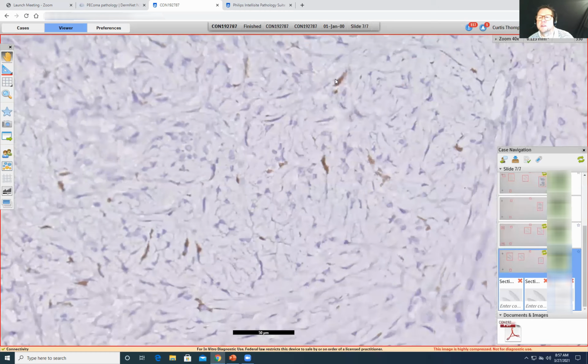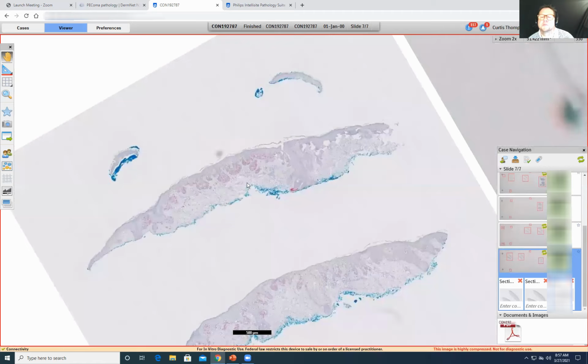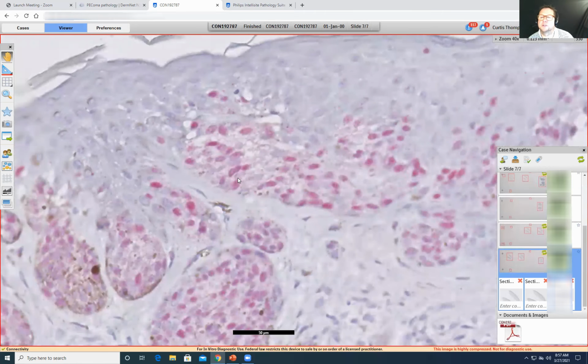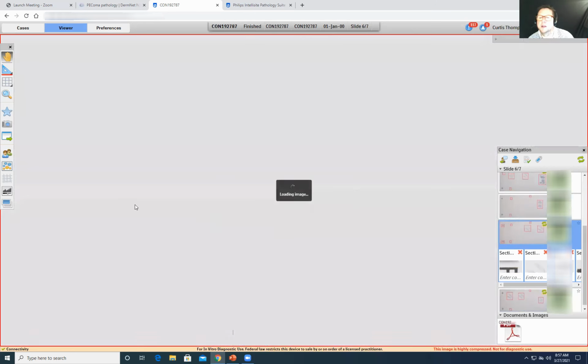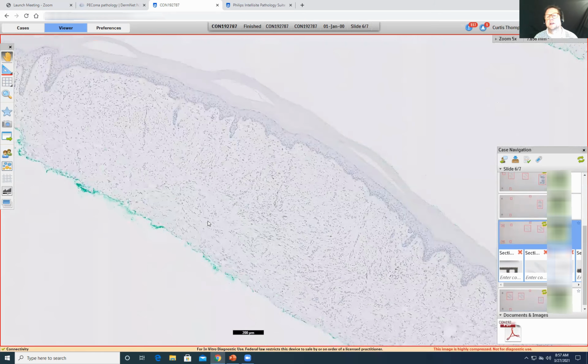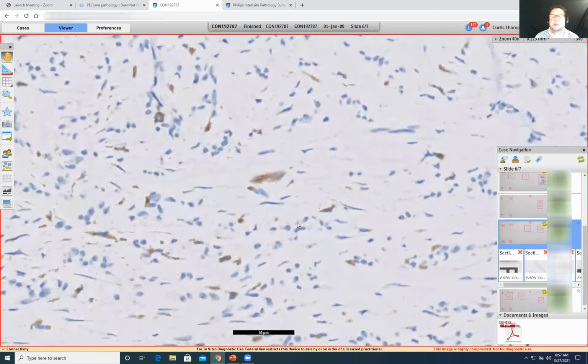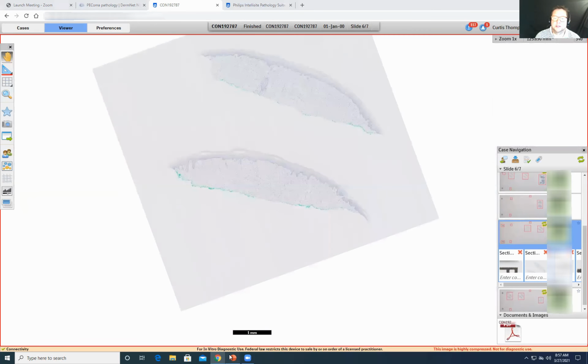But these are the pigment. This is not the staining of the immuno. And here's a positive for what an immuno would look like. So that is generally positive in melanoma and not in nevi. And P16 similarly was done here and also is negative right here. So once again, you can see the pigmented macrophages right there, but you can't see any staining.